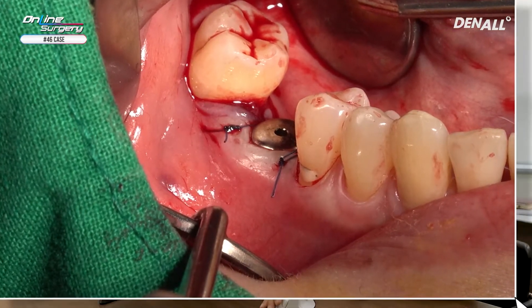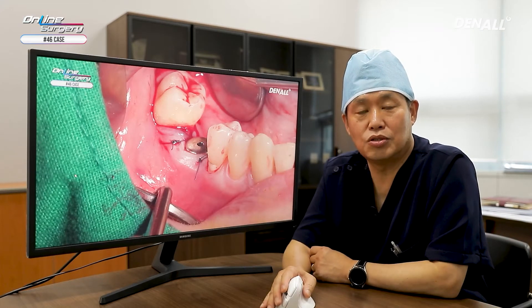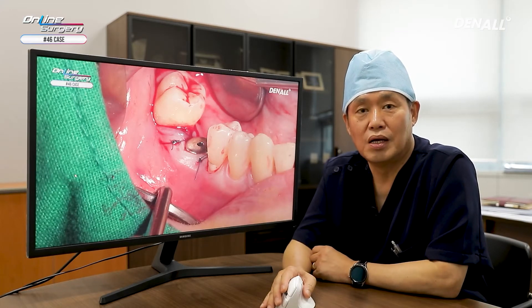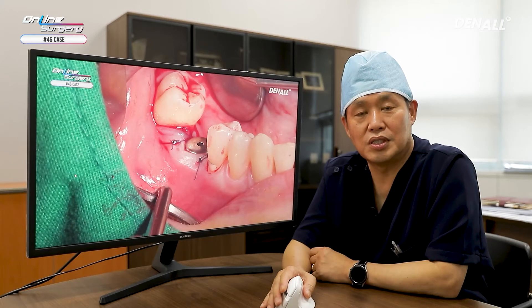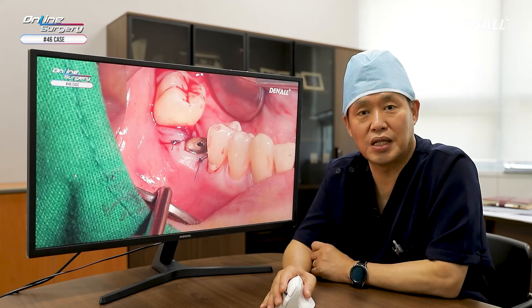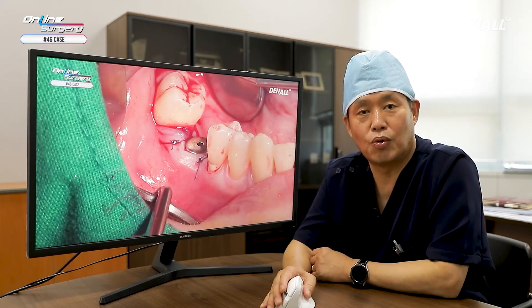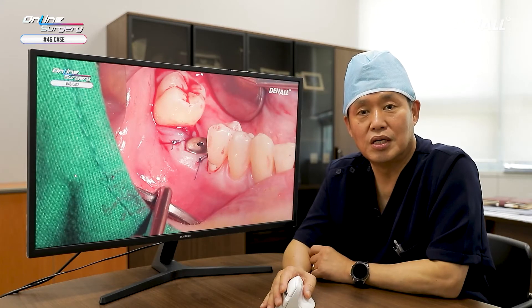Surgery is complete in the case of a lower posterior single missing case. At times, tissue level SS implant is used instead of TS implant. In these cases, when you use a TS implant, there can be sinking down. If you're concerned about those issues, you can use an SS tissue level implant. Because there's a stop superior to the abutment, you'll feel less stressed about sinking down or screw loosening. SS type implants have many advantages in terms of these aspects.